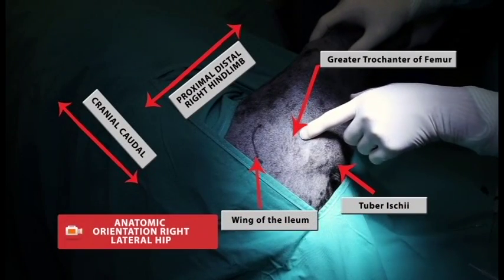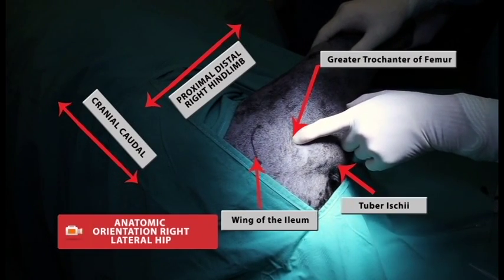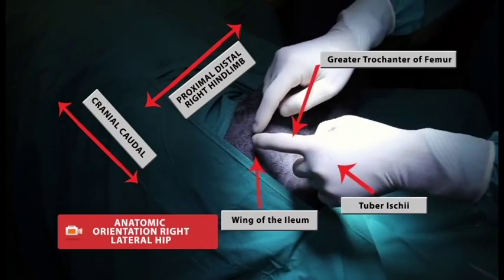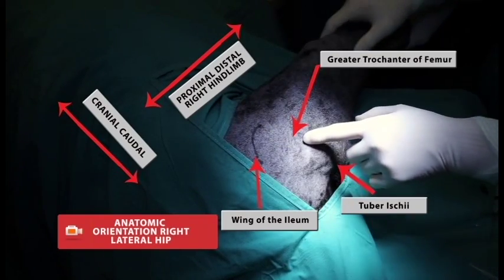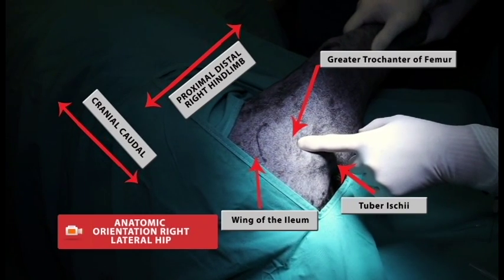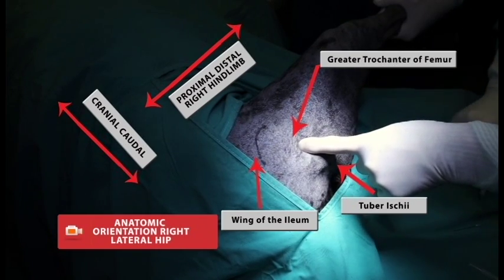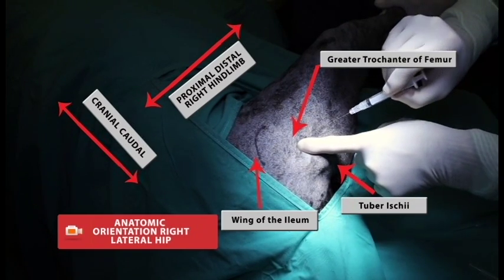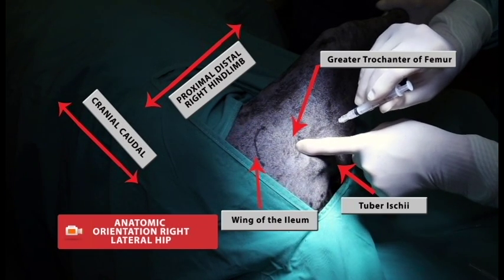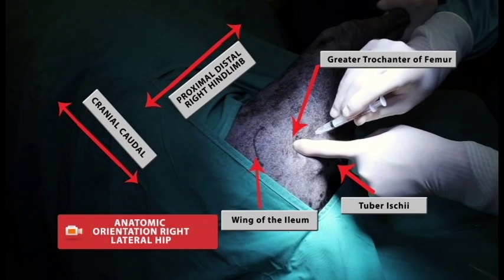For the lateral approach to the hip joint, your landmarks would be the greater trochanter of the femur and, for point of reference, the tuber ischiae and the wing of the ilium. We distract the hip joint just a bit and externally rotate. You want to go just proximal and slightly cranial to the greater trochanter at an angle and slowly insert your needle.